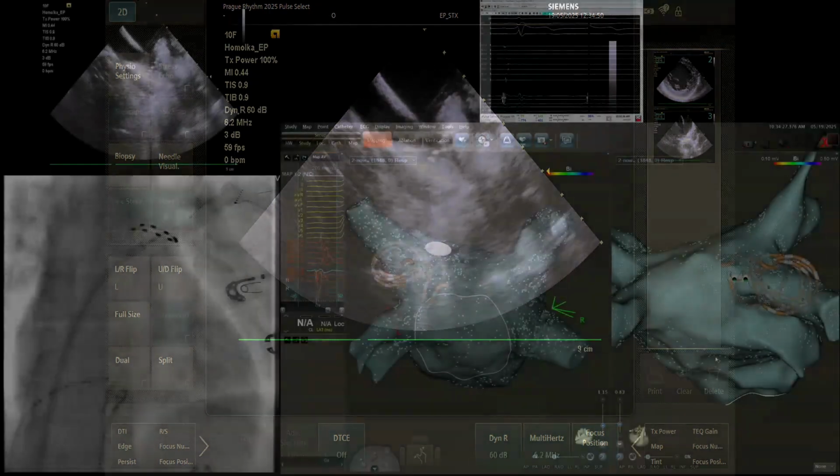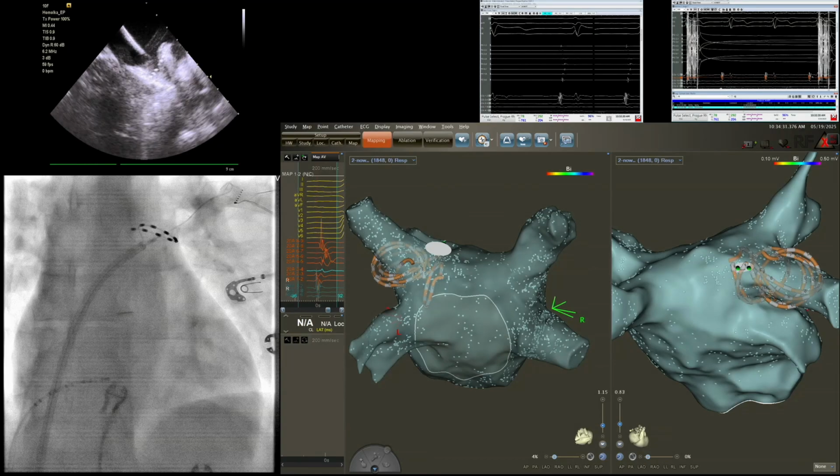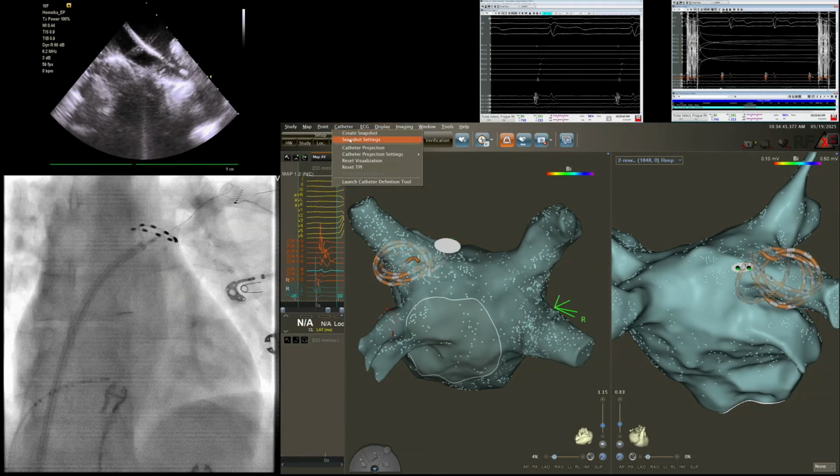Ridge appendage view. Okay, now we are sitting on the ridge. So look, I moved the catheter. Now we are clearly sitting on the ridge. Okay, but I don't want to put any. Okay, let's go. Last bonus. Okay, let's go, guys. Okay, shadow, last application. But it's a good position, I think.